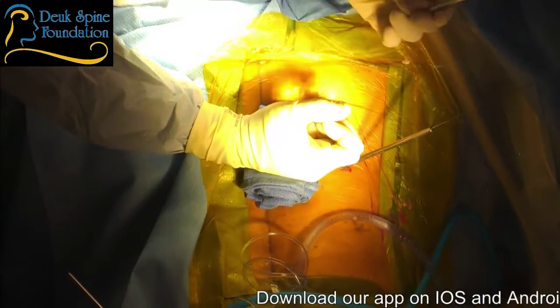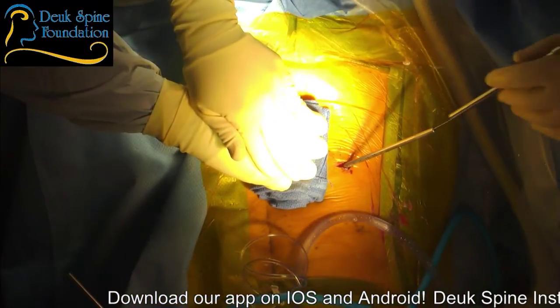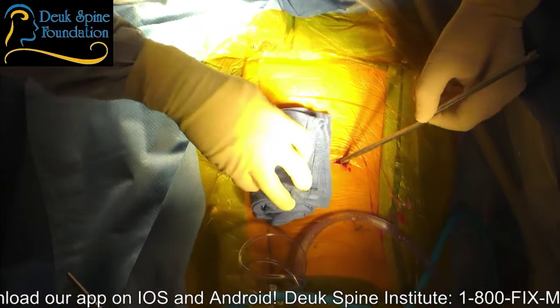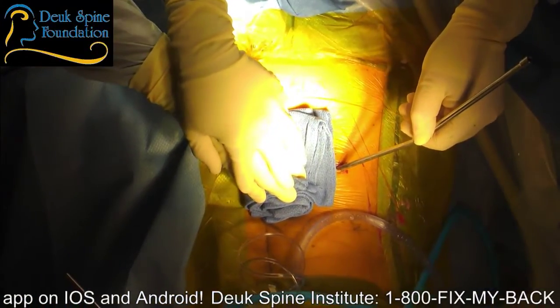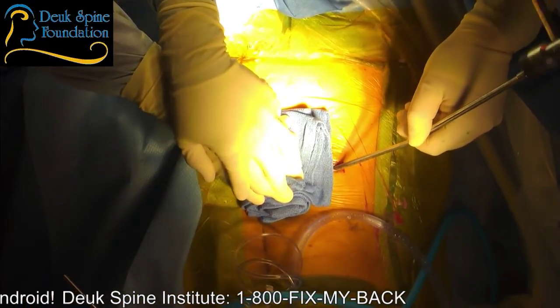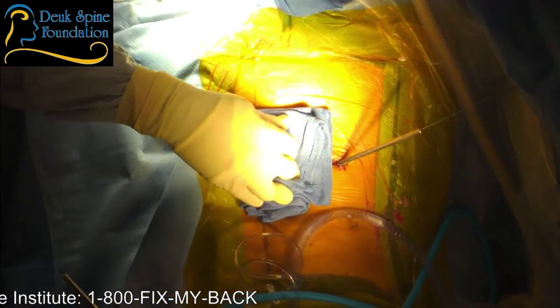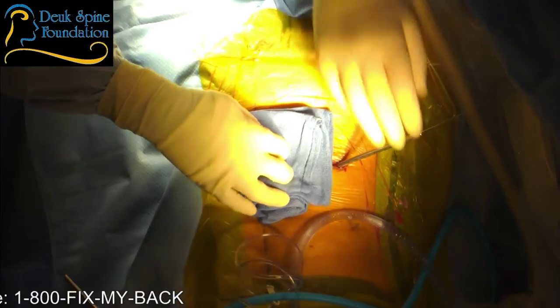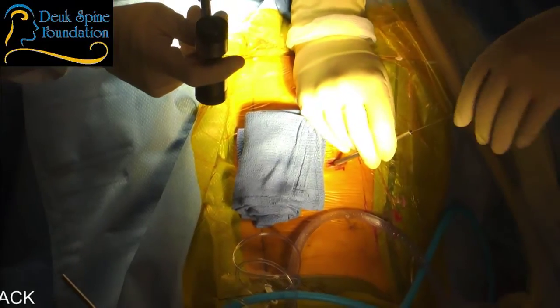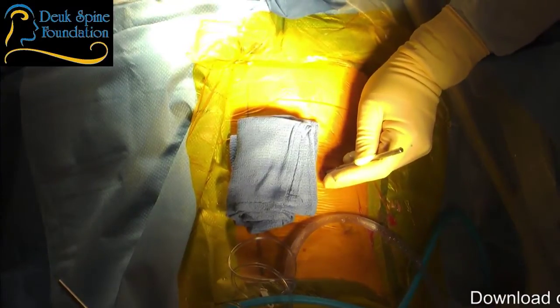Because if you don't have a giant herniation compressing the nerve, there's no point in doing a microdiscectomy. And if you don't have severe foraminal stenosis, there's no point in doing a laminectomy. You'd have to have symptomatic foraminal stenosis, neurogenic claudication, which is pain down your legs with walking and standing. So only the Deuk laser disc repair can fix back pain. Not laminectomy, not microdiscectomy. A fusion can fix the back pain, but not the decompressive procedures most of you are familiar with hearing about. All right, taking the guide wire out, still have the dilator, aiming at 45 degrees, shot.